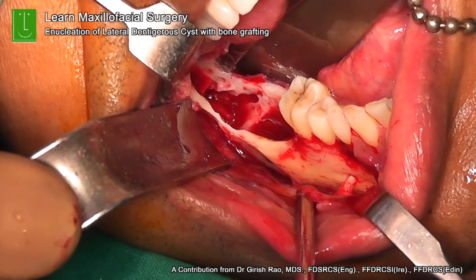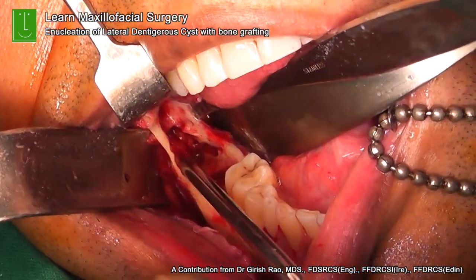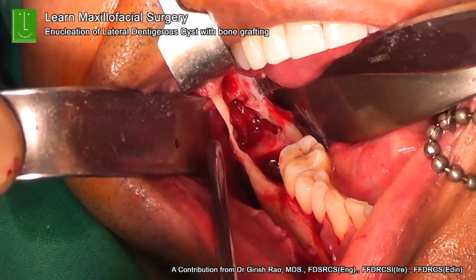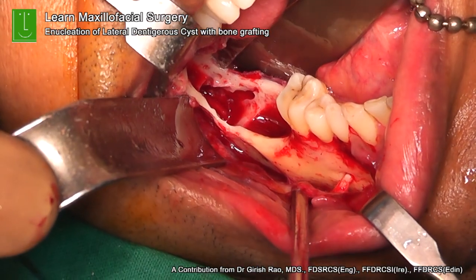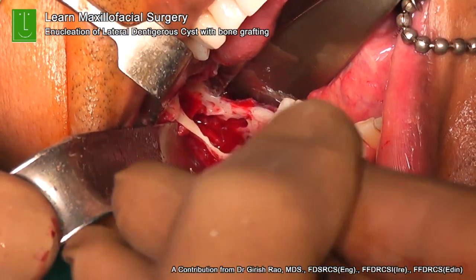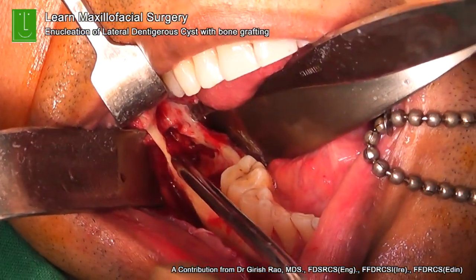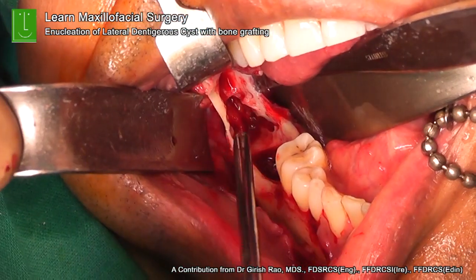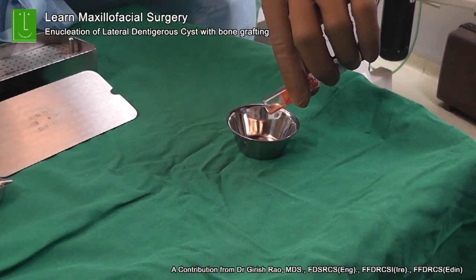Now, if you look carefully at the floor, you can see the neurovascular bundle there. That's the perforation which the cyst had created. So you can see the neurovascular bundle completely intact. That's very, very important because the sensation is preserved. The patient will not have a permanent numbness of the lip and chin region if you are respecting the nerve. So it's very, very important that you do that.